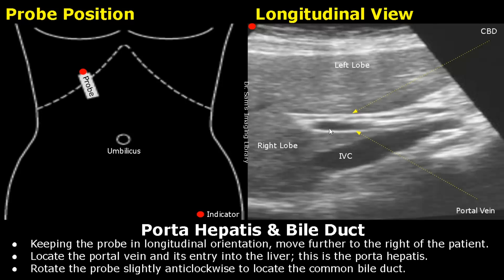This is the portal vein with hyperechoic walls. Then rotate the probe slightly anticlockwise until you see the common bile duct. It will be anterior to the portal vein. This is the common bile duct. You can measure its diameter in this view.